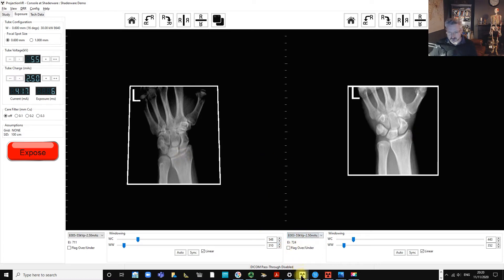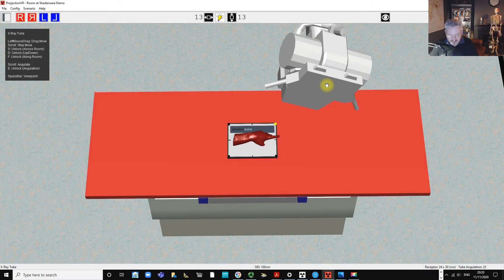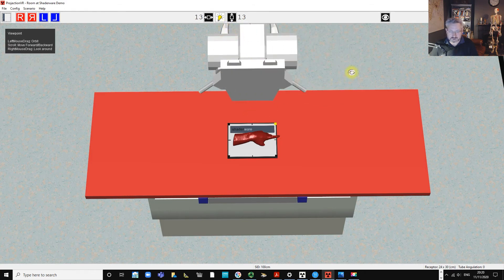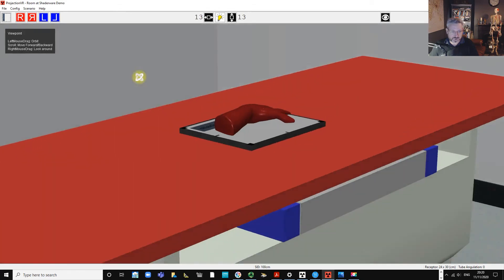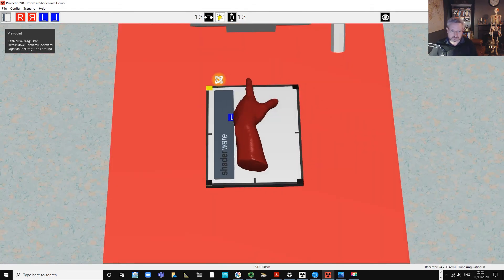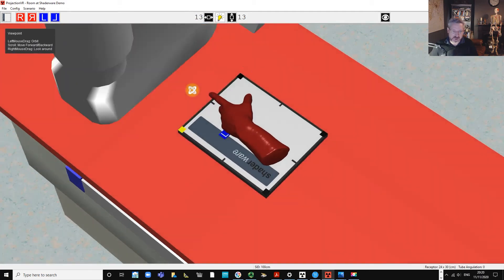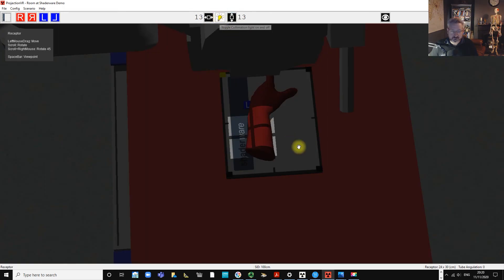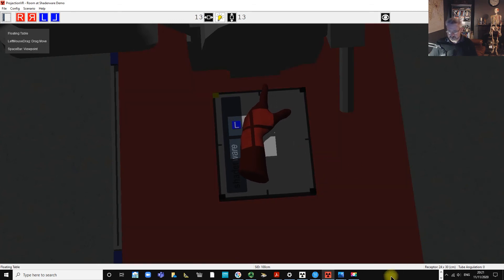Now on to the next projection: the oblique. We'll straighten the tube again, raise it back to working height, move it back to the middle, and this time rotate the patient's wrist. What we're looking at is a semi-oblique position — not lateral and not dorsal-palmer, but something in between. You can get steep obliques and shallow obliques; each book has its own discussion about which is optimal.